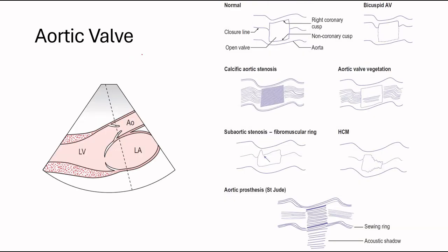Now we'll talk about the M-mode through the aortic valve. And this is a cross section of what it looks like. So this is the normal M-mode of the aortic valve. This is when the leaflets are closed. Over here, this area is when the leaflets are open. And you see that nice box. So that's the valve opening. On the posterior side, we have the non-coronary cusp. And the anterior side, we have the right coronary cusp. And this is the aorta.